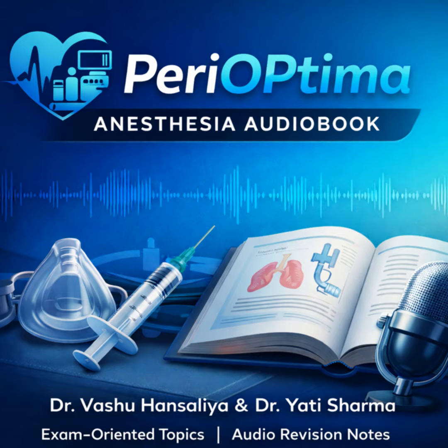Advantage 1, improved success rate. Yeah, the sources cite numbers like 95 to 99% success with ultrasound versus 70 or 80% with landmarks, plus faster onset and longer duration. Much better. Advantage 2, safety. You are visualizing the danger. You see the blood vessel so you don't inject into it. You see the pleura so you don't pop the lung. You see the nerve, so you avoid injecting directly into it.